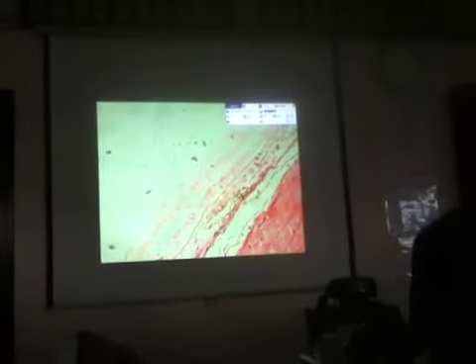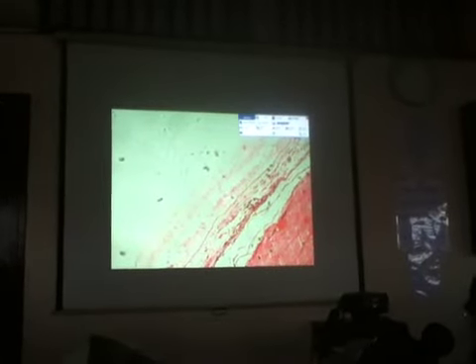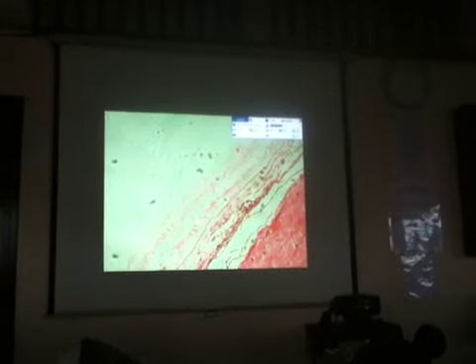What we will be able to see here will only be the nuclei of the three types of cells mentioned. Immediately at the vicinity of the pigmented epithelium are the nuclei of the photoreceptor cells, the rod cells and the cone cells.